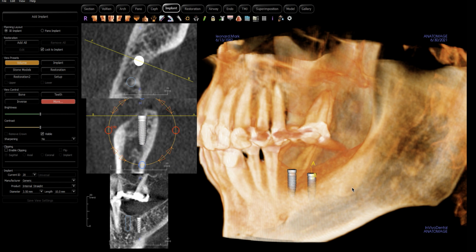As you do that, you do increase the crown to implant ratio, but crown to implant ratio is not the same thing conceptually as the crown to root ratio of a natural tooth. Mish talks a lot about this in his texts. With that said, I think clinically, if you control the occlusion very well, you can have a very strong crown to implant ratio. I don't think you're approaching anything here of any significance. I think 2-to-1 is really where you're starting to worry. 1-to-1, which would violate most tooth-borne situations, 1-to-1 implant to crown ratio is fairly common and highly successful.